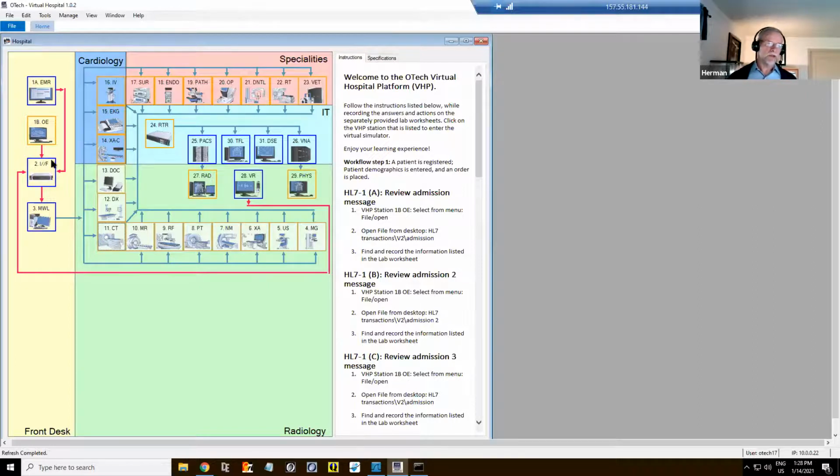For example, this blue is in a different virtual machine. The PACS is in a different virtual machine as well, right? To go through all of the different scenarios will take us another 2 weeks or so. But what we're going to focus on is the modality simulator, a workstation and a PACS system. Those are the 3 things we're going to focus on.